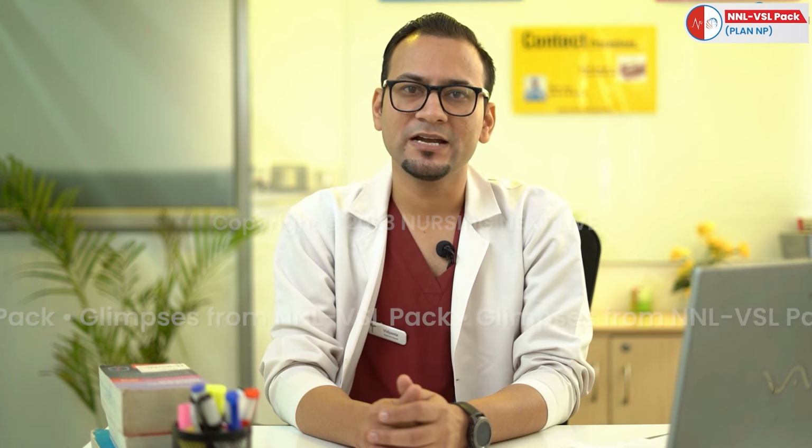There are certain contraindications of oxygen therapy. It is contraindicated in the patient who is having oxygen toxicity and patient with atelectasis. Oxygen therapy should be used with caution in patients with COPD, that is chronic obstructive pulmonary disease, because it may induce hypoventilation. In this video, we are going to demonstrate the two types of oxygen devices. First is the low flow oxygen devices and second is the high flow oxygen devices.